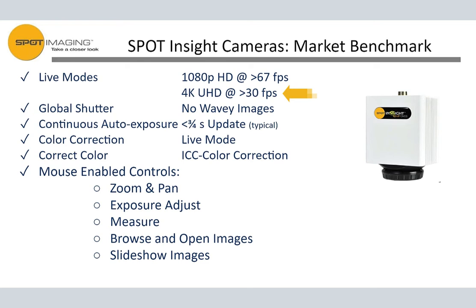It's providing about a 9.3, I think, megapixel, whereas 4K is normally 8 megapixel, and it's running at over 30 frames per second. Generally, we see it running at about 33 to 36 frames per second. These all work off of the fact that you have a modern computer, because we actually use all that computing power to be able to provide these high speeds.